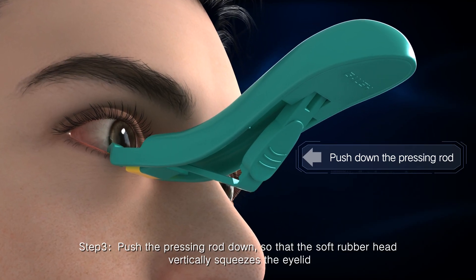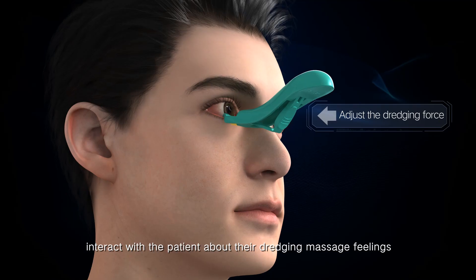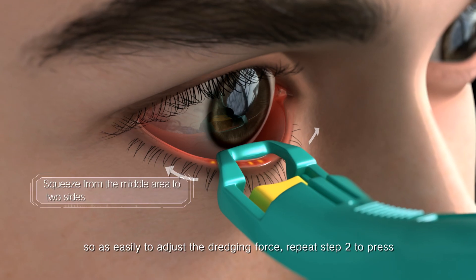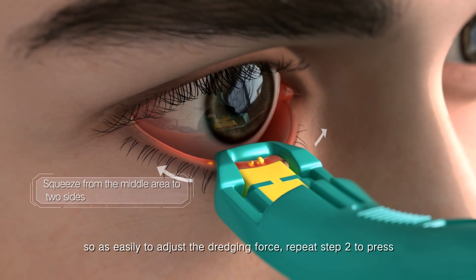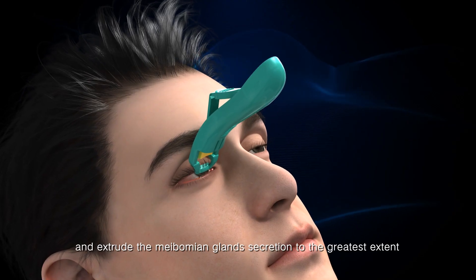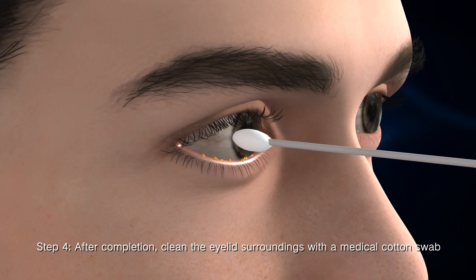Step 3: Push the pressing rod down so that the soft rubber head vertically squeezes the eyelid. Interact with the patient about their dredging feelings so as to easily adjust the dredging force. Repeat Step 2 to press and extrude the Meibomian gland secretions to the greatest extent.